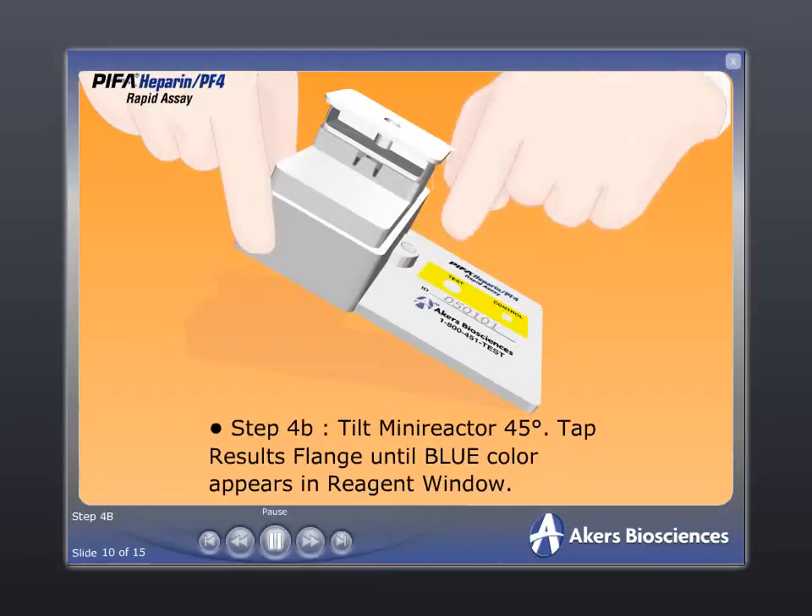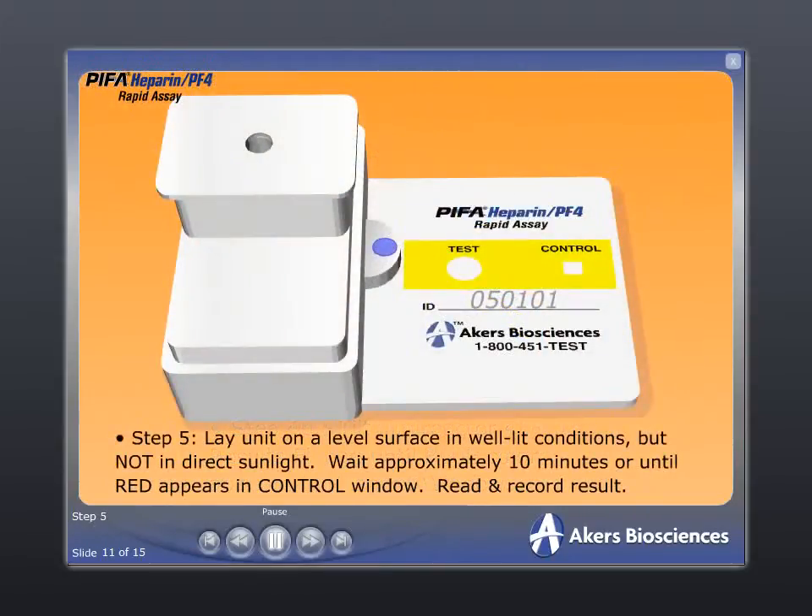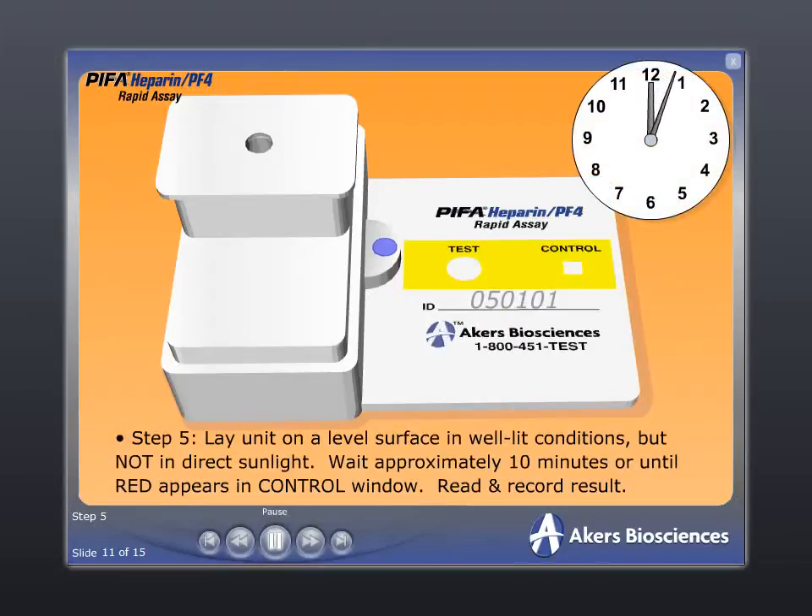Tap the device with your finger until a blue color appears in the reagent window. Step 5: lay the unit on the table and wait approximately 10 minutes or until a red color appears in the control window. Read and record the result in the test window.